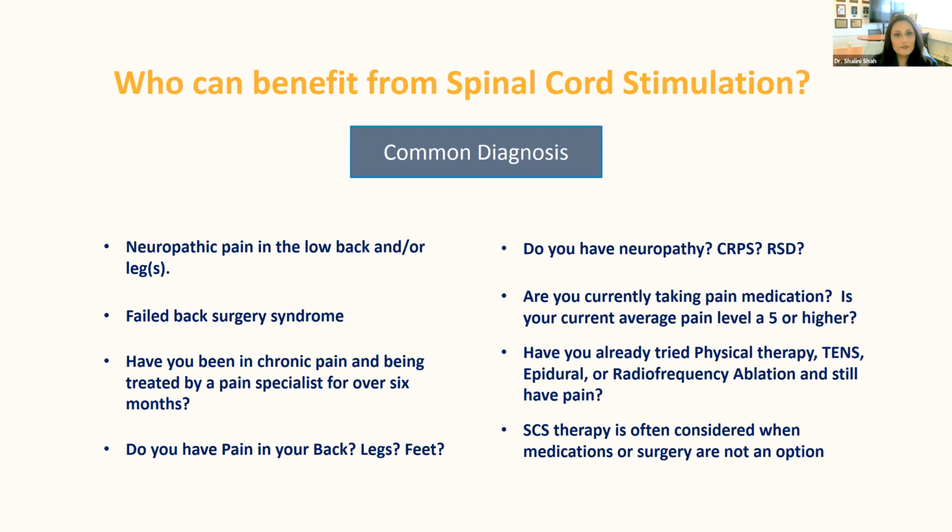We do a trial first. That means we put the leads in and we send you home. You trial it out for anywhere between 3 days to a week, and you come back and let me know, yes, this worked for me. Hey, I'm able to do much more than I was able to do before. You know, doc, I just didn't need as much medication, or I slept better. So these are fantastic options that you can trial at home, without having to go into a permanent surgical solution, to see if you like it before you make it permanent.